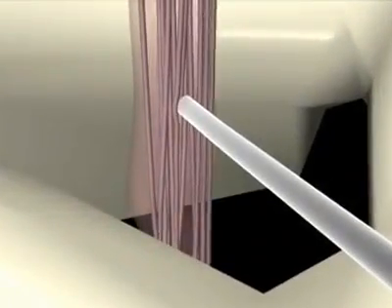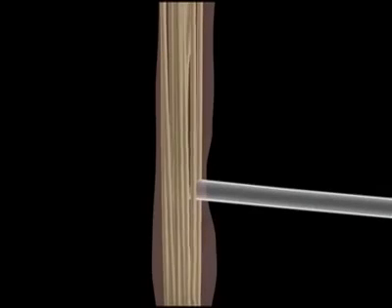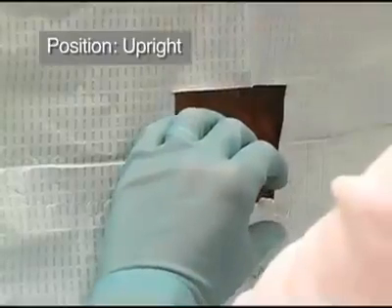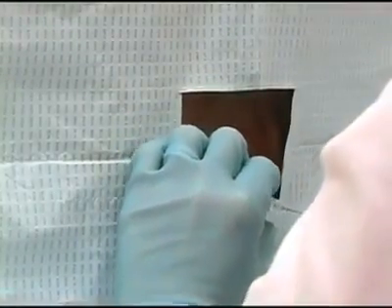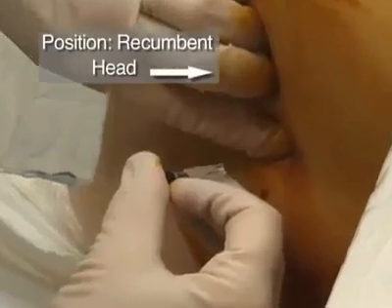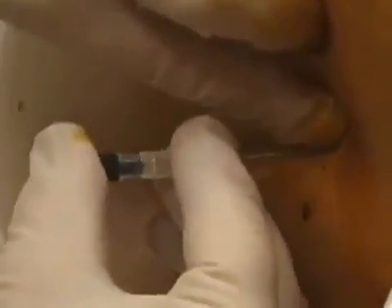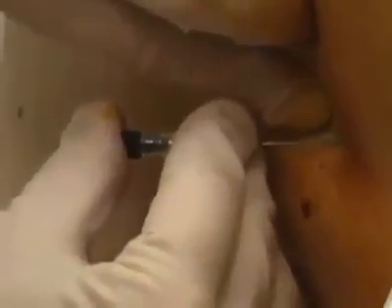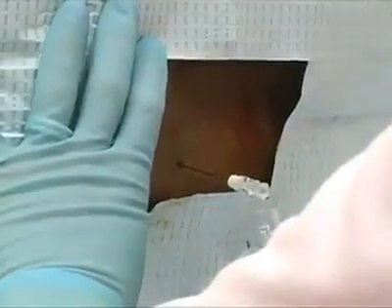As the needle passes through the ligamentum flavum, you may feel a popping sensation. Once you have reached this point, the needle should be advanced in 2 mm increments and the stylet withdrawn after each increment to check for CSF flow. If no fluid is detected and bone is encountered, withdraw the needle to the level of subcutaneous tissue without exiting the skin and redirect the needle. Fluid will flow once the needle enters the subarachnoid space.